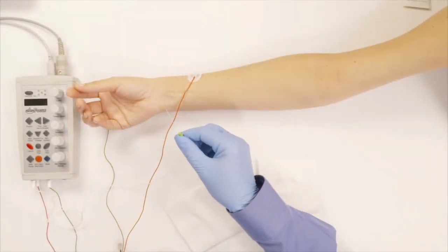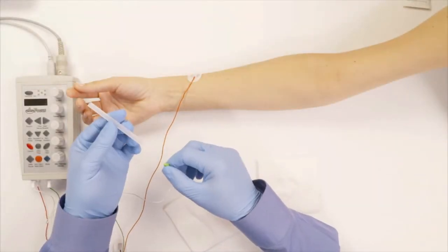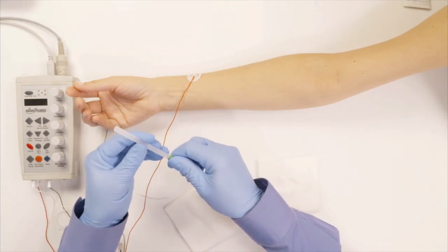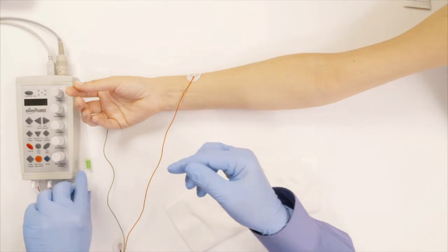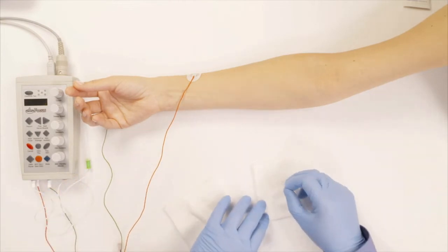Before going to the next muscle it's better to shift the needle again to avoid sticking the patient and sticking yourself. So I did that, put this by the side, and now I need to identify the next muscle.